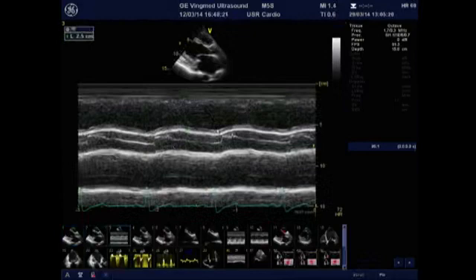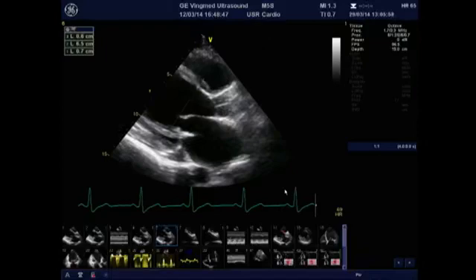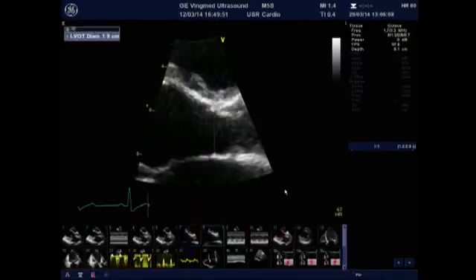And of course, it's part of the examination to assess the diameter of the aortic root with M mode. In still frames, you can confirm that the left ventricle measures in telediastole 65 millimeters, which means it is dilated. Also, you can confirm that LV walls are not thickened. There is no LV hypertrophy. The next step is to assess the left ventricular outflow tract for further measurements later, and you can see how we should measure the LV outflow tract diameter.